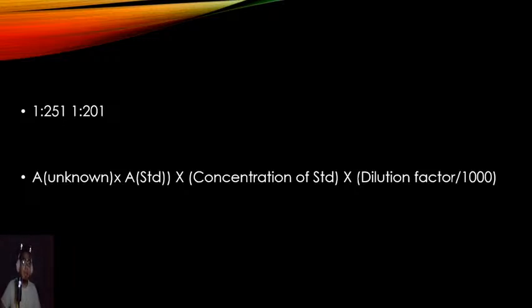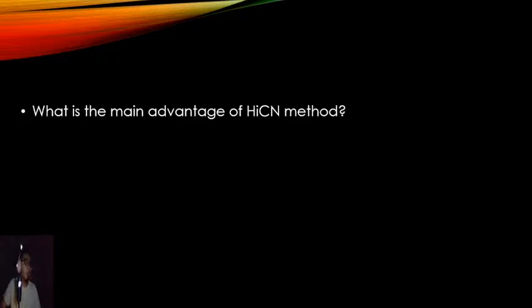According to the books that I've read, it has always been 251, and very rarely do I see computations used in 201. It's usually 251, but I added 201 in the equation, so you guys have options. Most of the time, the standard dilution is 251.